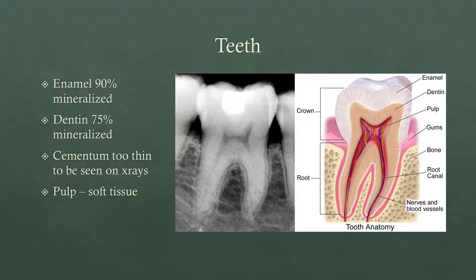Enamel is more mineralized than dentin, which is why it shows up as more white. But this material here that is completely white — I would call that completely radiopaque — that has to be some type of metal, and in this case we know it's likely an amalgam restoration. Enamel is sometimes 90 or 95% mineralized. Dentin is more similar to bone, where it's about 75% mineralized. Cementum follows the outline of the roots of the teeth, but you're not going to see it in x-rays — it's too thin.